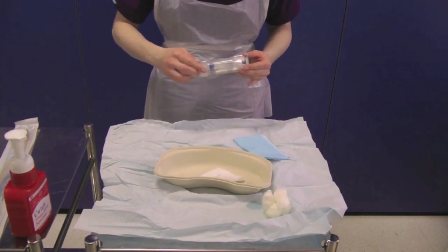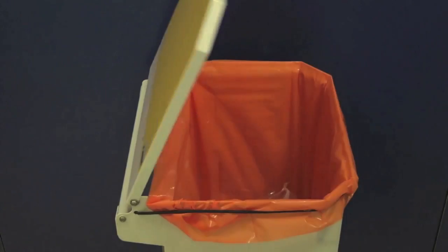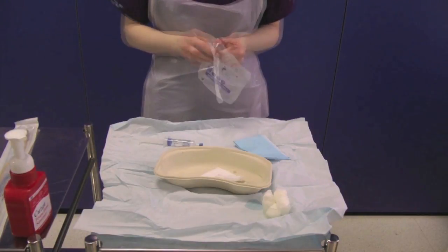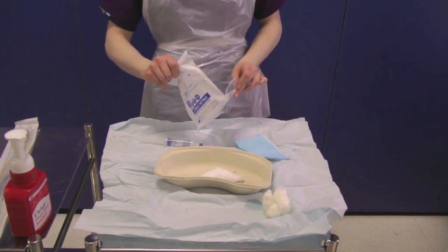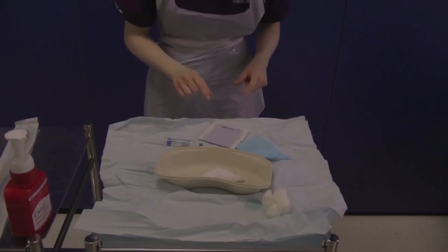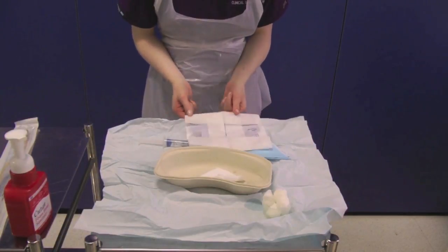Open the outer packaging of the prescribed Instillagel and drop the syringe onto the sterile field. Then open the sterile gloves and drop the internal packet onto the sterile field. You must now decontaminate your hands as you have been touching outer packaging. Carefully open the sterile wrapping ensuring you do not touch the sterile field and put the gloves on.